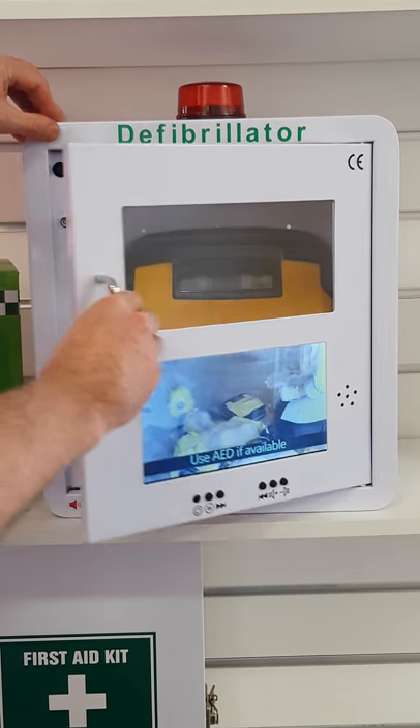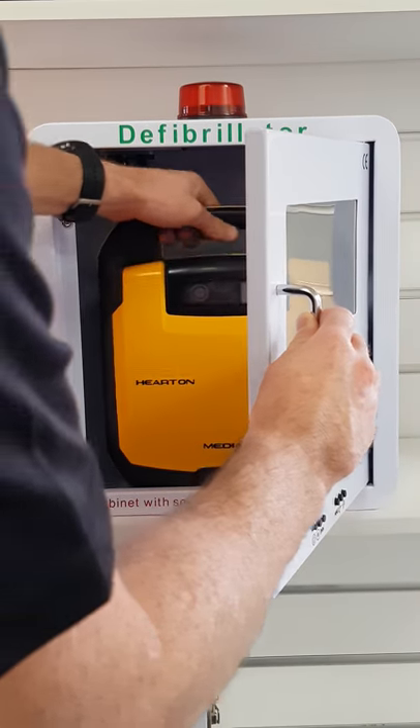If an automated defibrillator is available, turn on and follow the instructions.